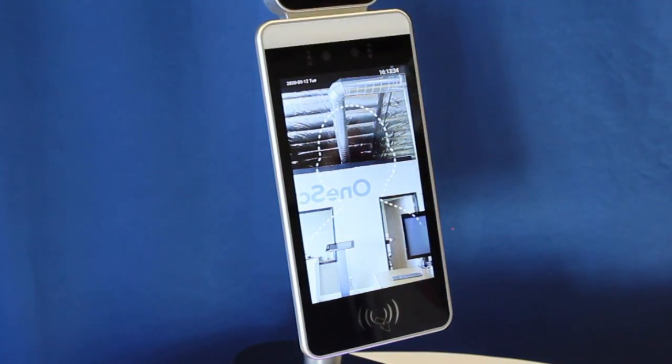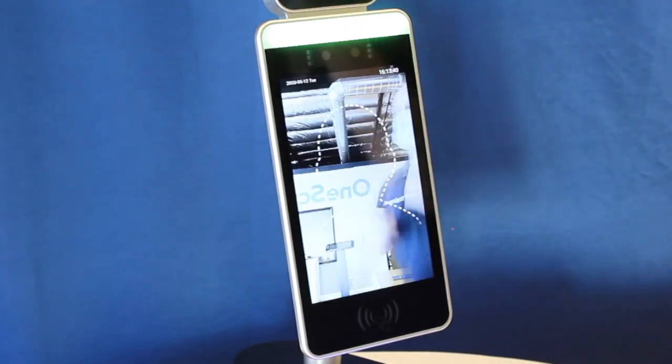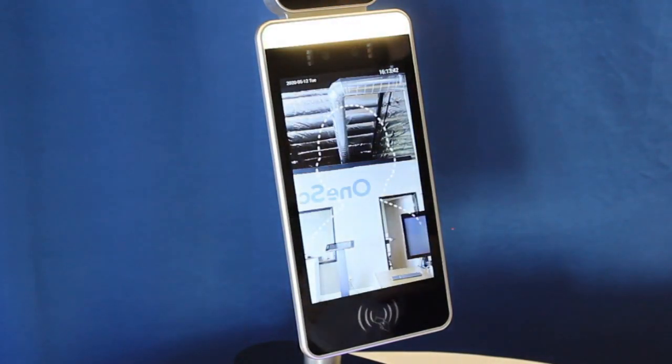Now I'm going to wear my mask and attempt re-entry. As you can see, I've been recognized by GoSafe and allowed entry.